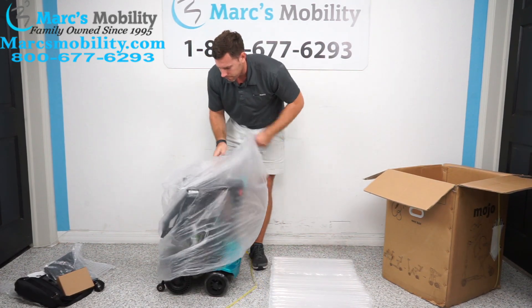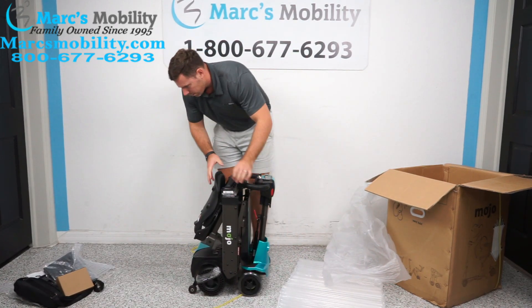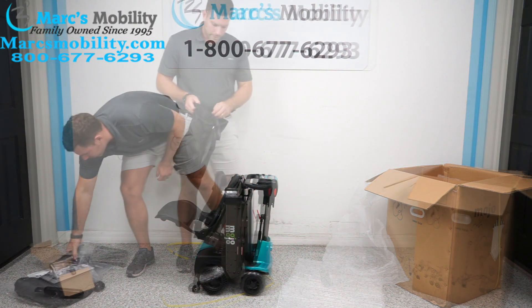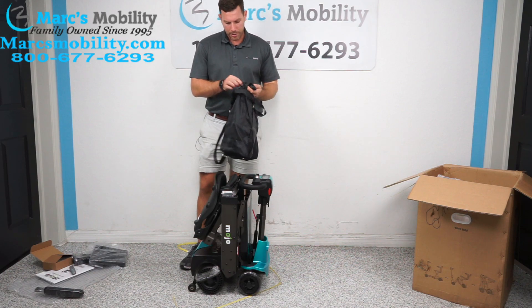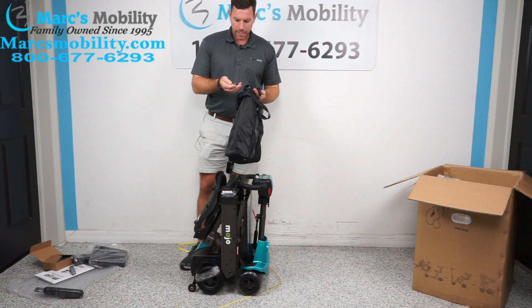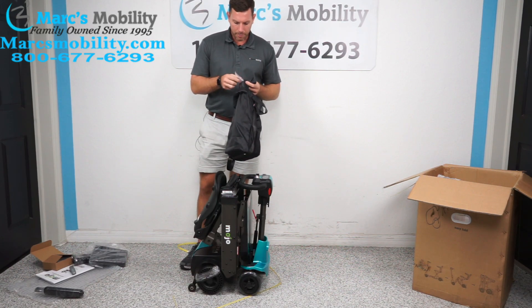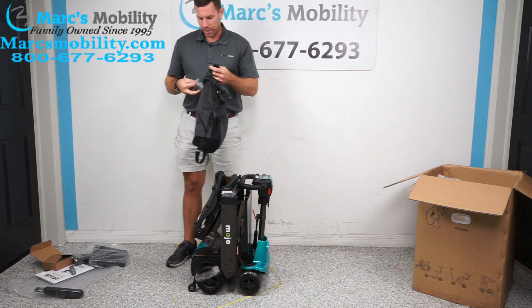We'll take the plastic off and look for our keys. Inside your bag up top, there's a zipper, and in that zipper it does have your keys and an Allen set. These are your automatic key fobs, and then it looks like some screws, probably for the armrests.